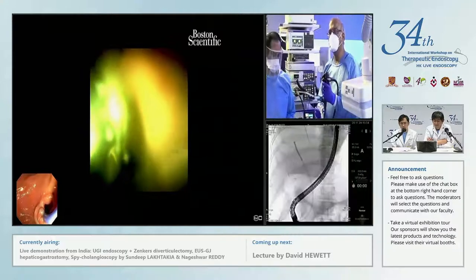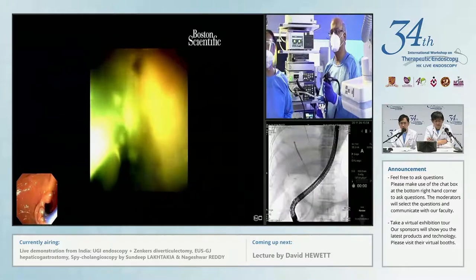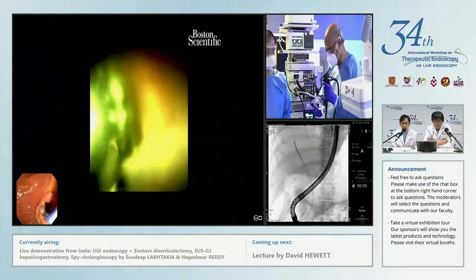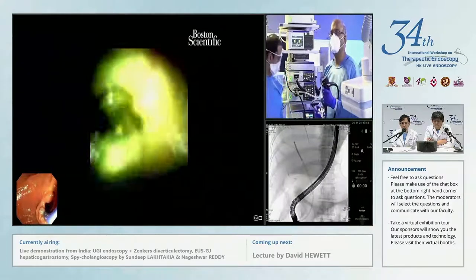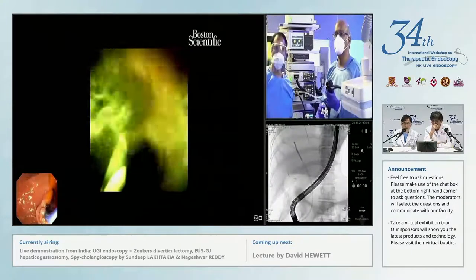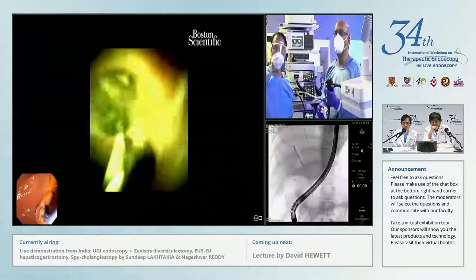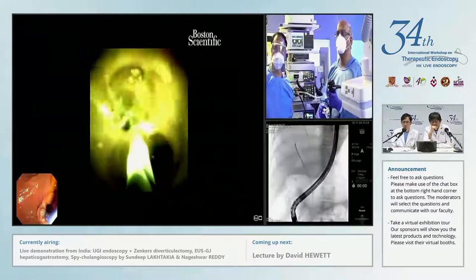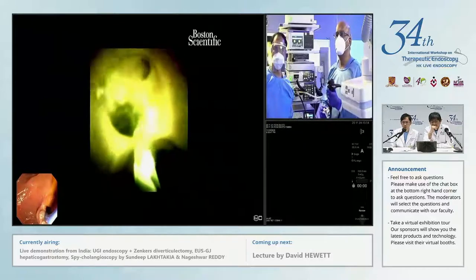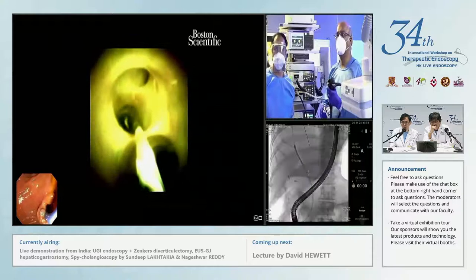What I'll now do is adjust my cholangioscope so I go to the center of the field. As I'm watching, I get to the center of the field, then put some water to see what we have. So I'm now infusing saline, and you can see there's some muck there because we are high up in the right anterior hepatic duct. So Raymond, can you see the pictures there? Cholangioscope picture, you can see the very nice... Yes, beautiful images here. Intraductal segmental ducts that you're seeing.